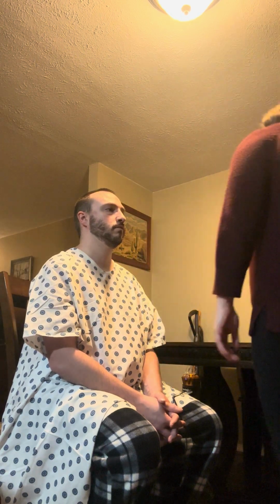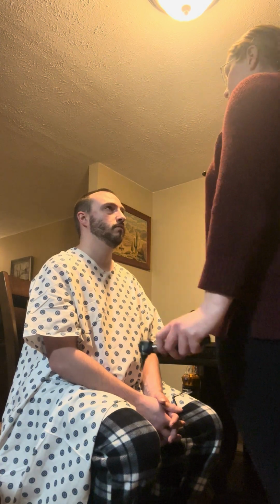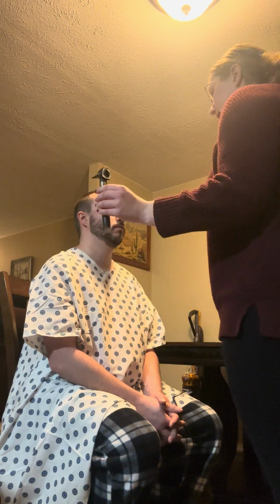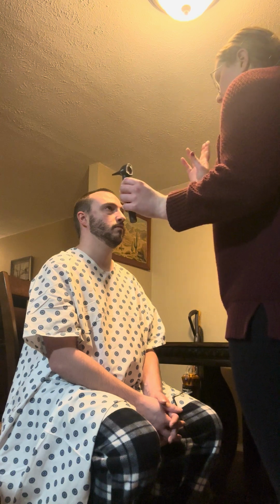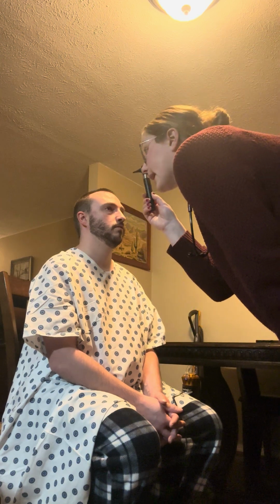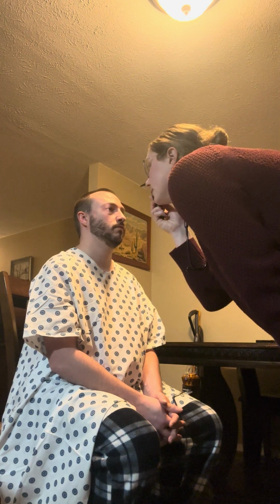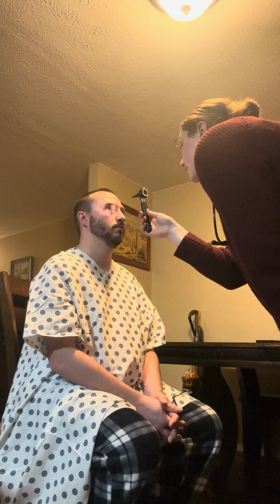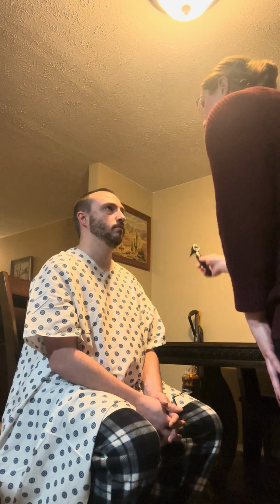So now I'm going to take my light source, and I am going to have you look straight at me, and I'm going to shine my light into the right side of your eye, into your pupil. And with my right eye, I'm going to use the ophthalmoscope, and I'm just going to check for, okay, and the right eye constricts from a 4 millimeter to a 2 millimeter.